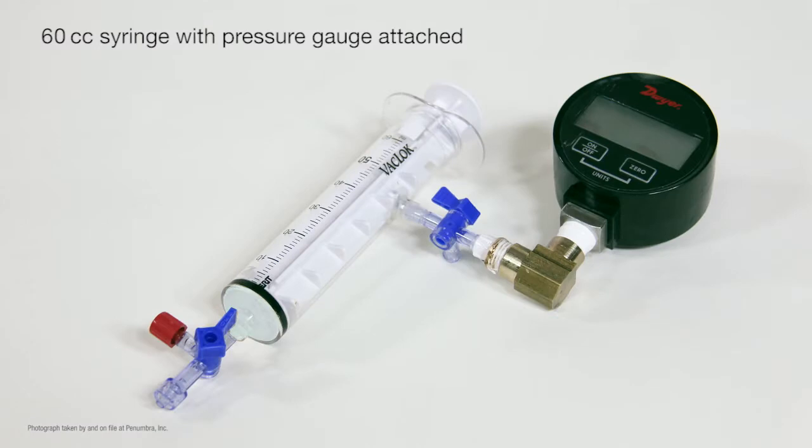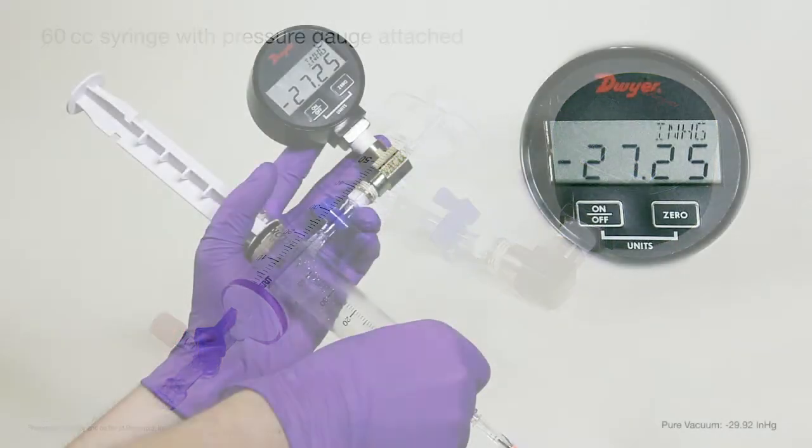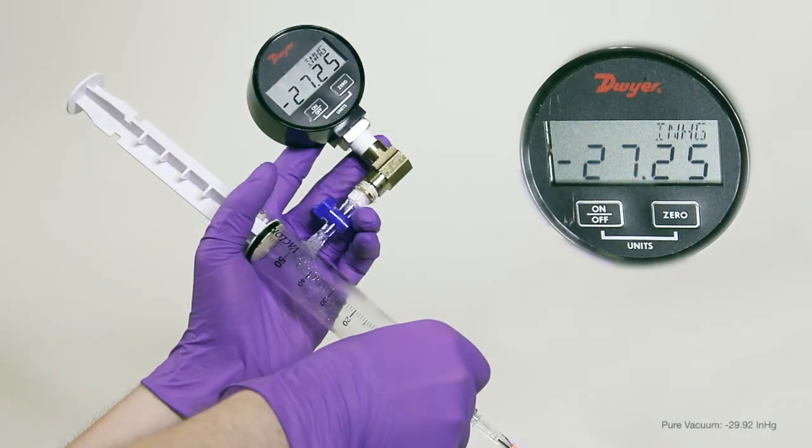Here we have a vacuum-locked syringe attached to a pressure gauge. For the test, we will attach a manual aspiration catheter to the syringe with the distal portion of the catheter submerged in water. Pure vacuum is minus 29.92 inches of mercury, the equivalence of one atmosphere. The syringe pull measures less than pure vacuum due to small pockets of air within the syringe.